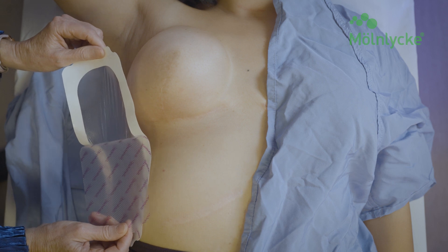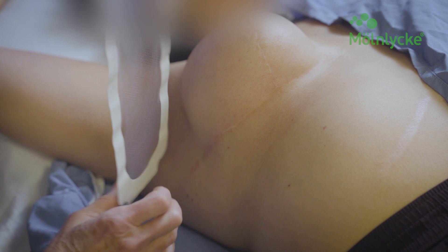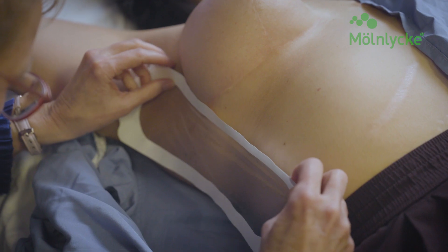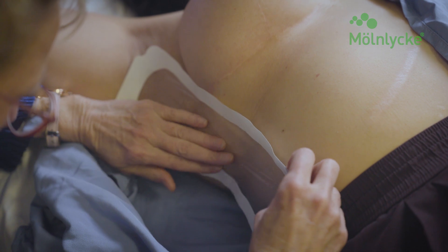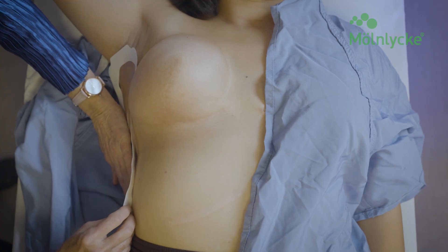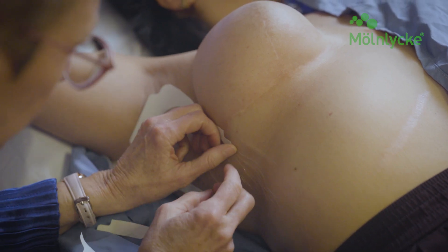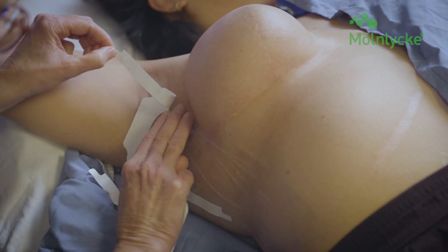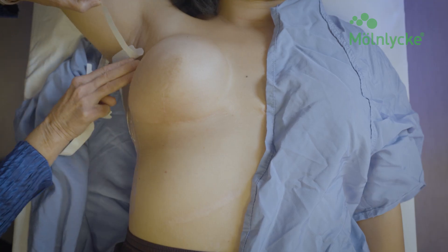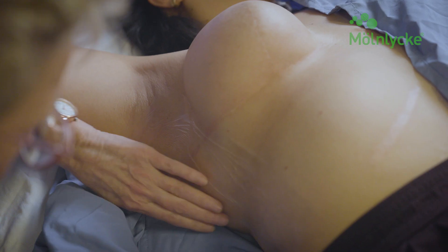With the patient in the correct position, take one 10 x 25 cm dressing, remove the paper backing, and lay the film down on the skin starting from the mid-axilla area and landing on the lower chest area. Avoid stretching the Mepitel film — instead, gently lay and press the film into place. Place it about 2.5 cm beyond the tattoo mark, ensuring suitable Mepitel film coverage to this area.